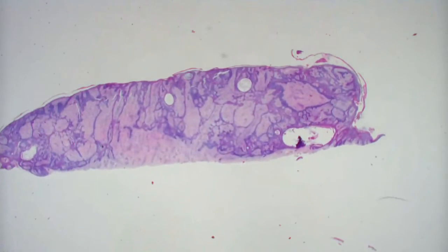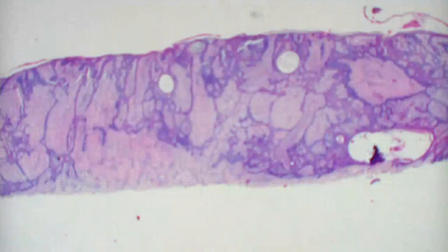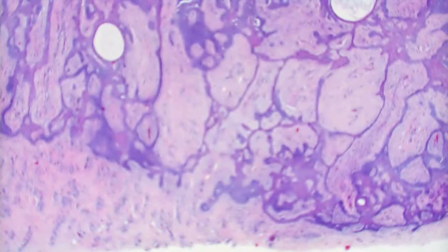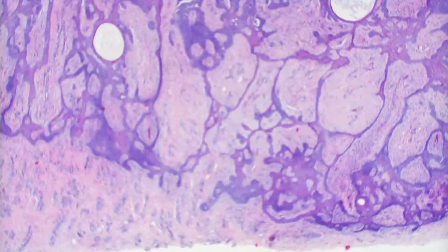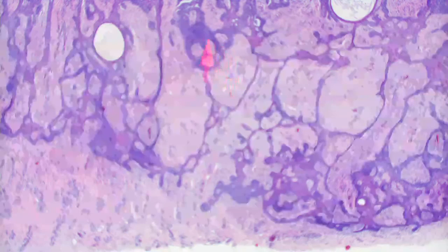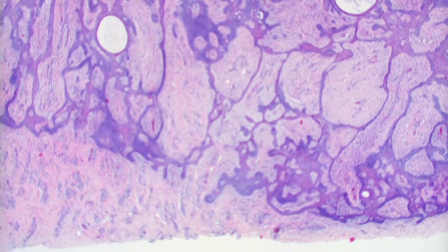Now, since it's such an easy, obvious thing that you can get at 1x, what's in the differential diagnosis of this? Syringofibroadenoma looks a lot like this as well. Excellent. Very good. It has little ducts in it. Good. So if you just had these little strands like this, you could say it could be a syringofibroadenoma. It looks pretty similar to that. But you don't get these structures that look a little bit more like a basal cell carcinoma than that. Okay, so that would rule that out.